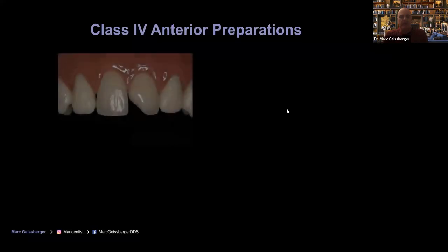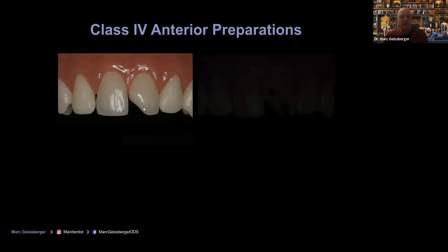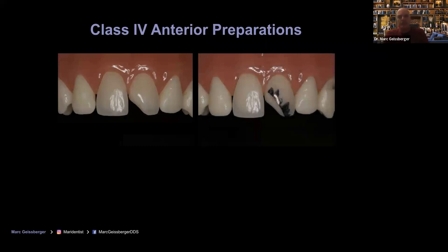Now, when Justin came in for the treatment, I'm going to employ that same irregular bevel. Okay. I want this to disappear. I want you to not be able to see his restoration. Now, here's a typical fracture far bigger than Justin's. And the first thing I would do is employ this irregular bevel. Okay. That's critical. The second thing I need to do is break up this straight line.